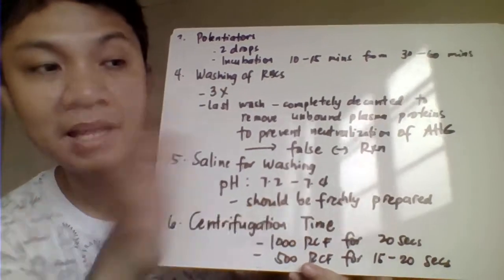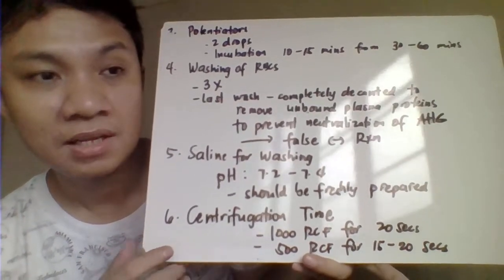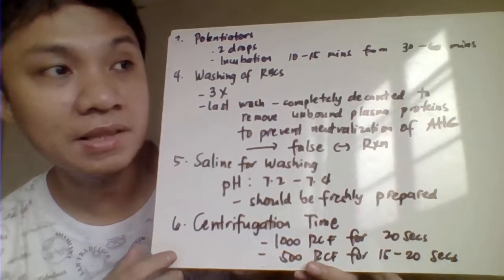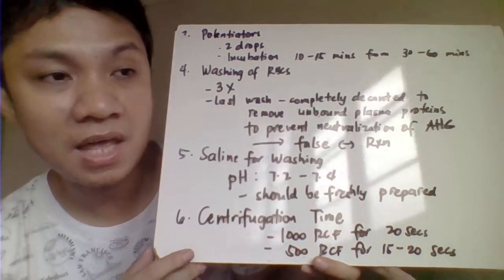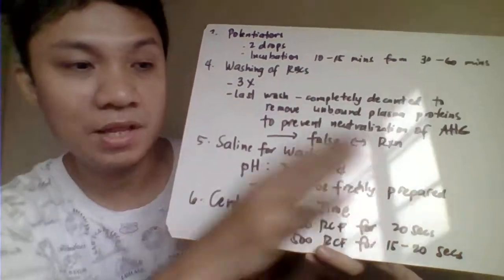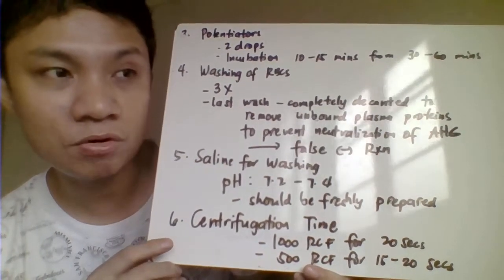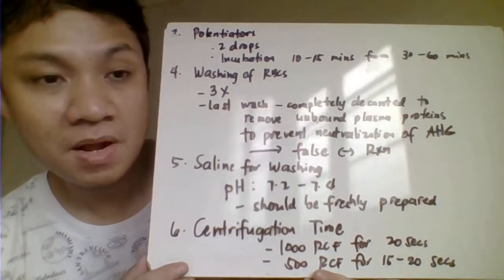Baka naman pag decant mo, hindi ka na-form ng pellet at the bottom here after centrifugation, sasama silang lahat, mawawalan ka ng reactants. Another thing, on the last wash here, on the ika-third na wash, make sure that majority of your saline has been removed. So, dapat adequately decant.